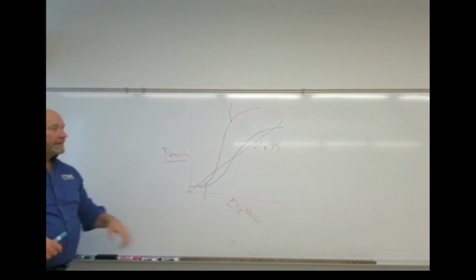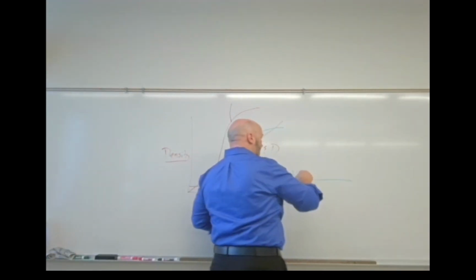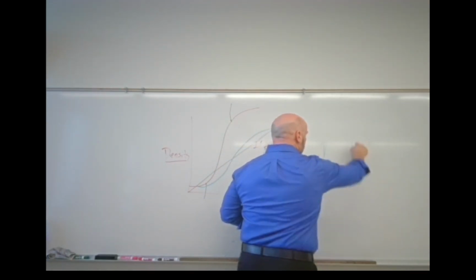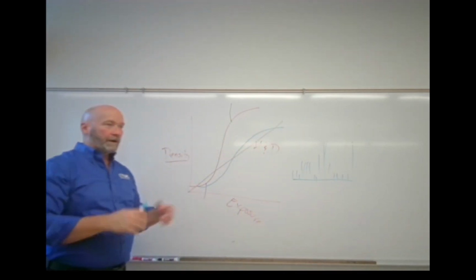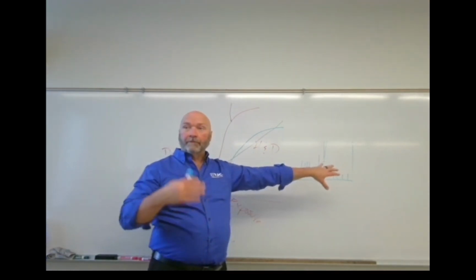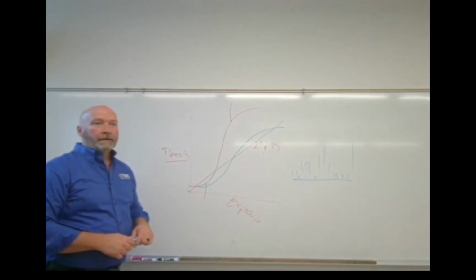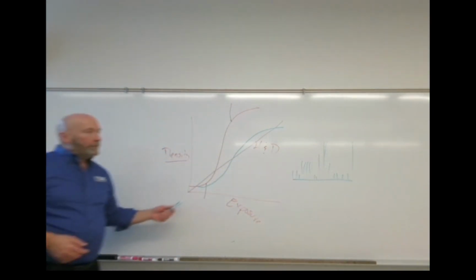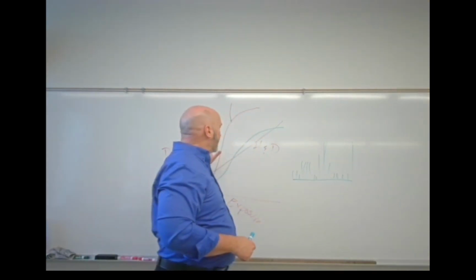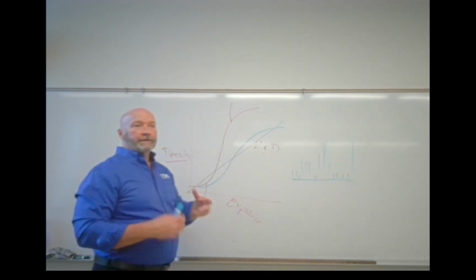In image processing, what you're going to see is the computer algorithms are just going to be these lines that look like this. If you were to get into your computer algorithm and look at your lookup table, the algorithm you create whenever you make your exposure, it's just going to be lines you can't make any sense out of. Okay? So for the stored computer algorithm, that is your lookup table, they assign an H&D curve to it. Okay? It's just a visual is all it is.